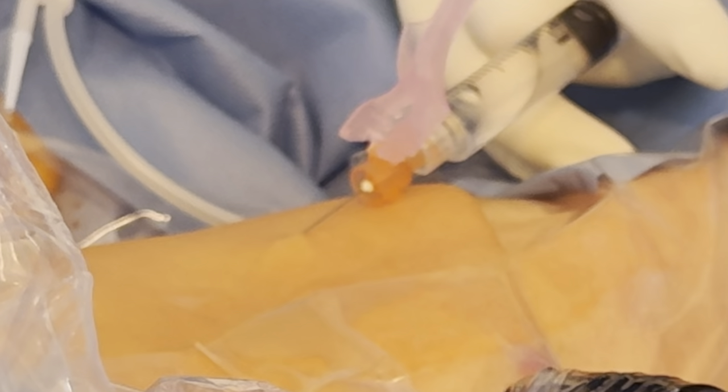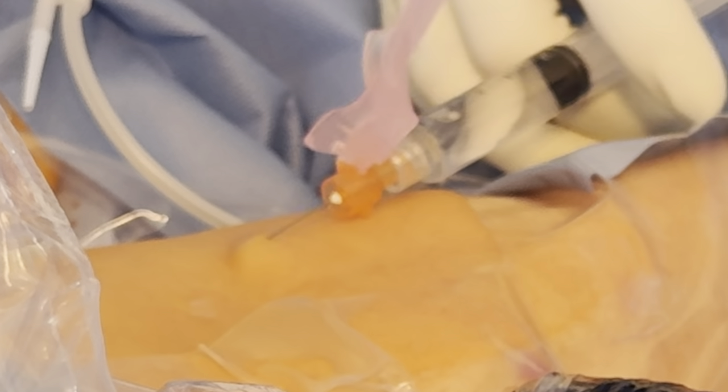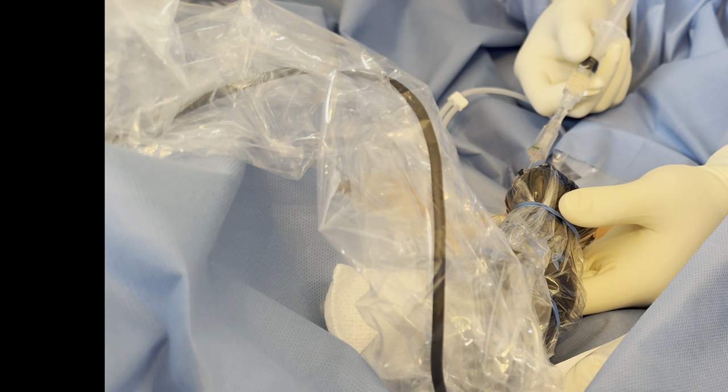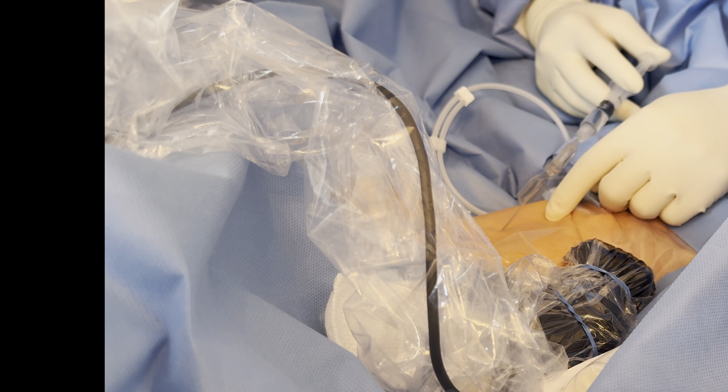I'm going to approach a little bit from the right — the vein is a little bit off center. I want to tap that vein right here. I have about a five-centimeter lead that I'm probably going to track from the skin. Remember, the butterfly probe is fat — take into account that extra centimeter from the center line where the ultrasound beam is actually emitting from. Ready for the pinch? Here we go. From here, you want a good intradermal wheal. If you do not see that intradermal wheal — is it burning a little bit? Yeah, a little bit. So I'm going to inject lidocaine while I'm going.